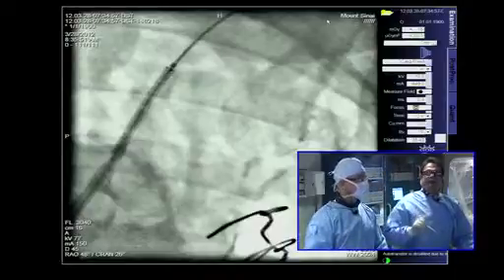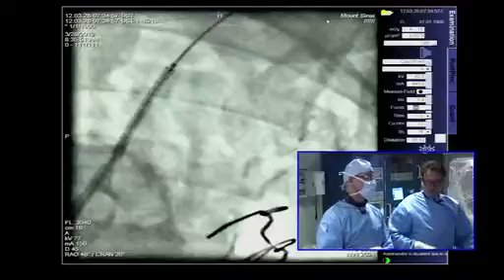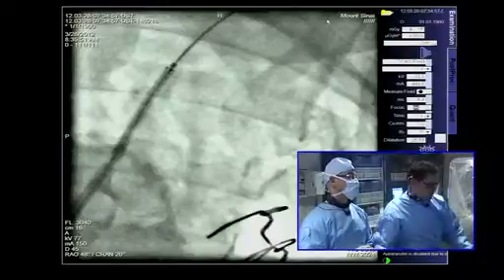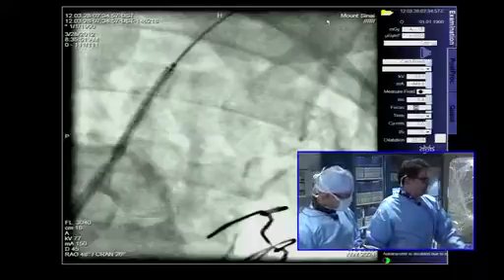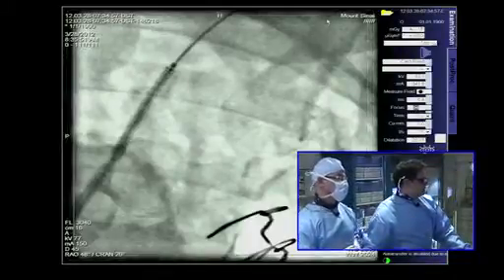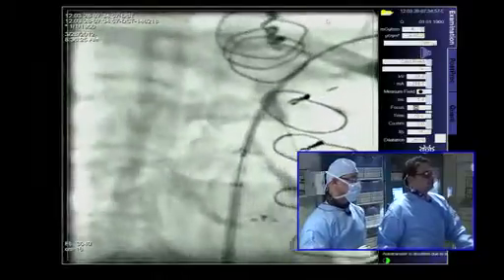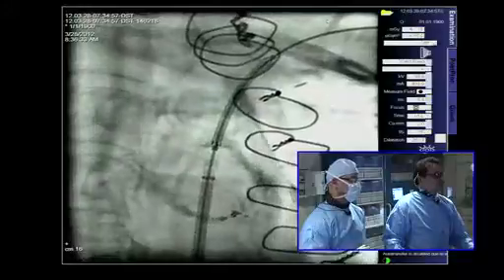And so now you've seen exactly where we are in terms of the vert. Now I'm going to have Dr. Wiley go to the two views that are important, and I think as part of the teaching of this case, one of the two things that we want to see is exactly why I can move my C-arm. I want to tell you how to hit the ostium. So the two views you want to look at when you look at the ostium, even though this is not a case for aorta ostial subclavian stenting, I think it's important as part of our teaching to show these two views. So one is the RAO cranial here, inject.